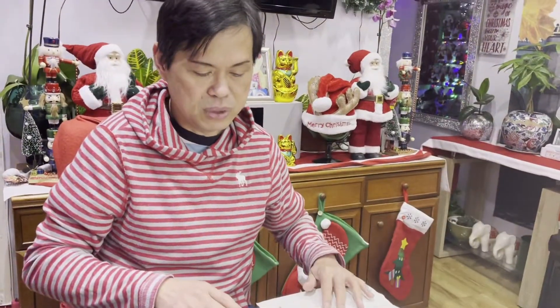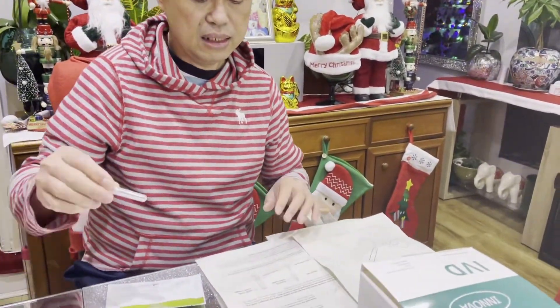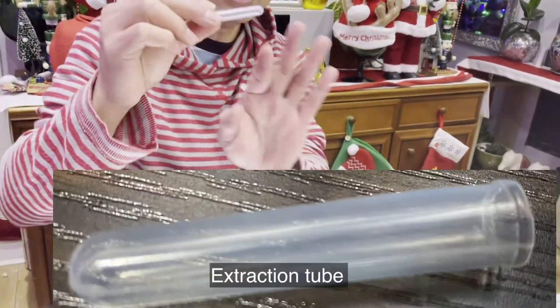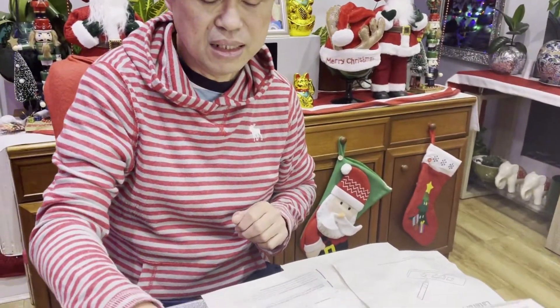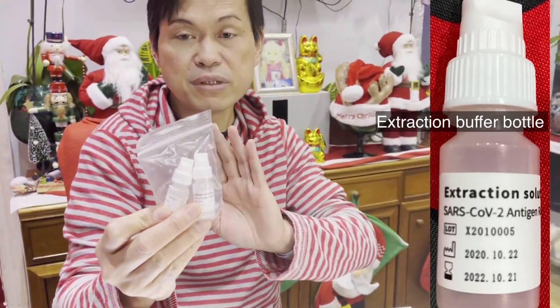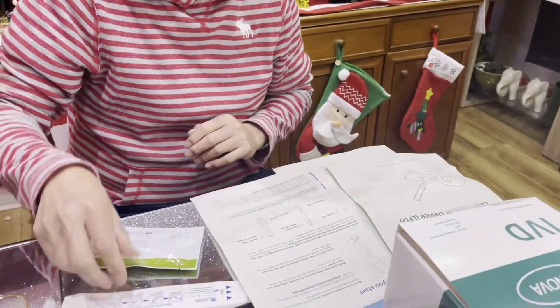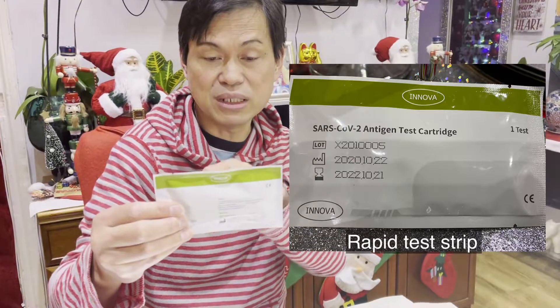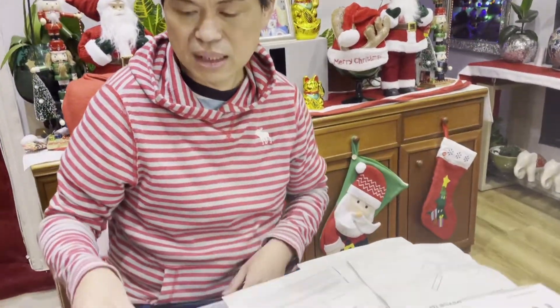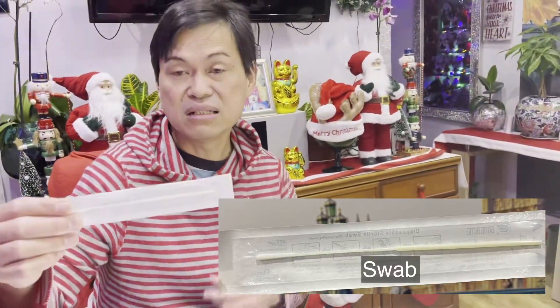We have the nozzle cup, the extraction tube, and the extraction buffer bottle. We also have the rapid test strip which is in here — I'm going to open that one later — and the swab inside the sealed wrapper.